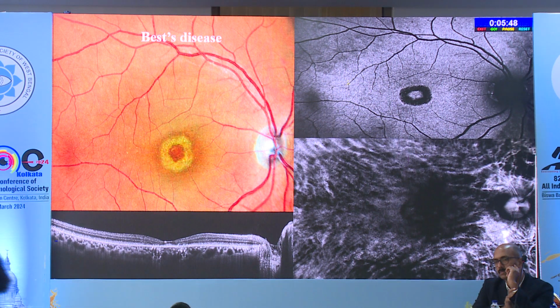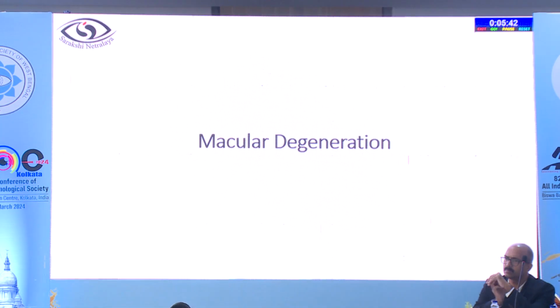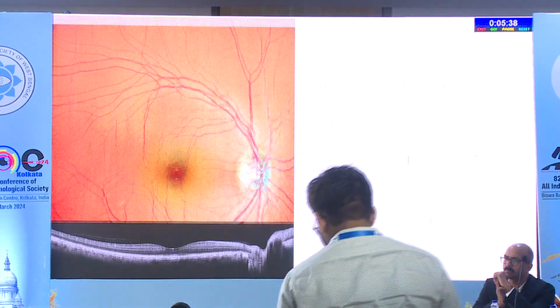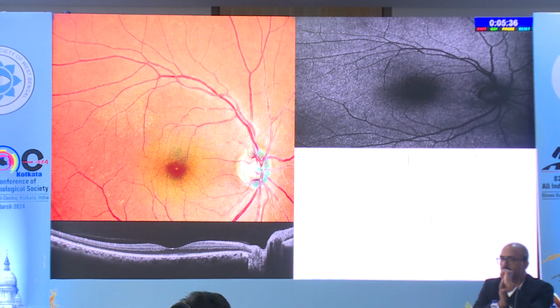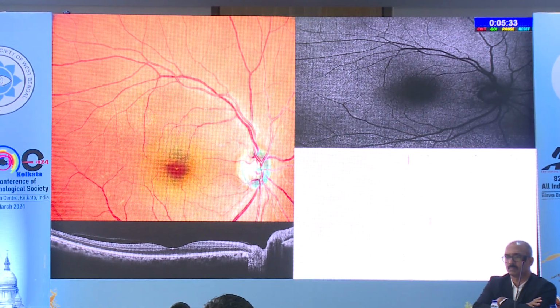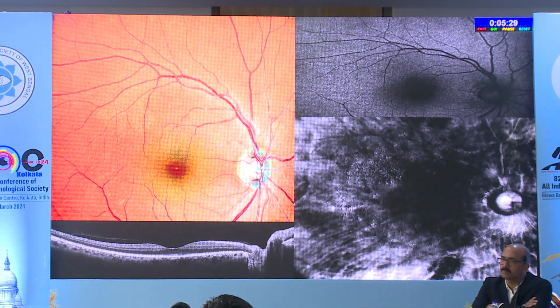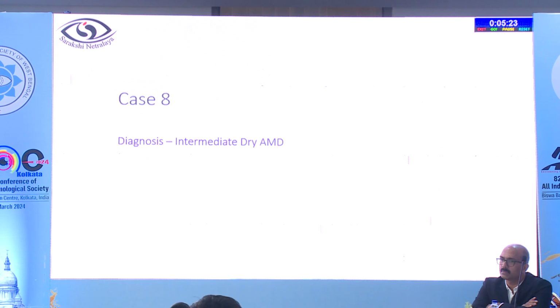In this case, the retro mode was not much contributory, as it only showed the block fluorescence in the central area.